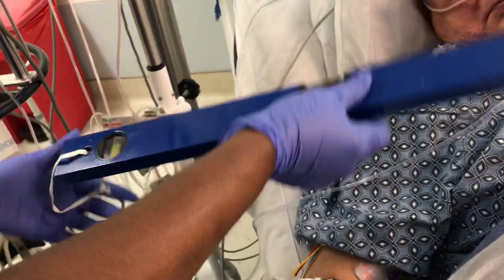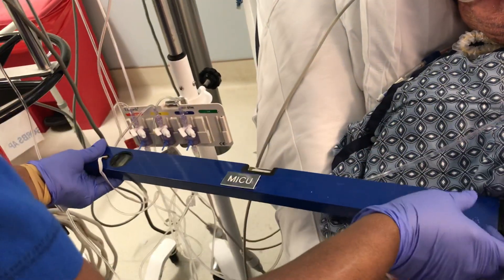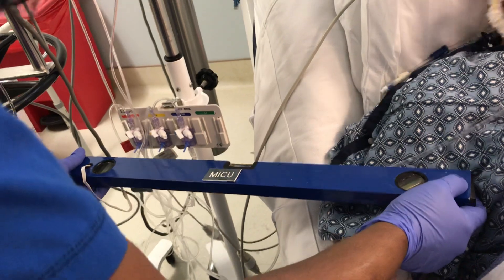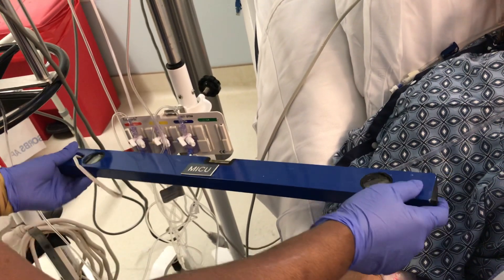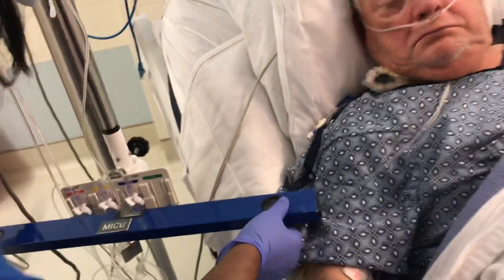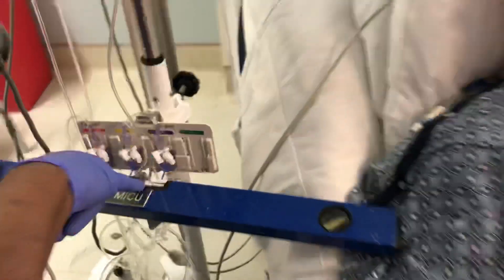See where my bevel is? This is like the fourth intercostal space mid-axillary. If you look, bring your arm out still. Yeah, right up over there. You see where my bevel is? It's lined up with that. It's right there in the center.